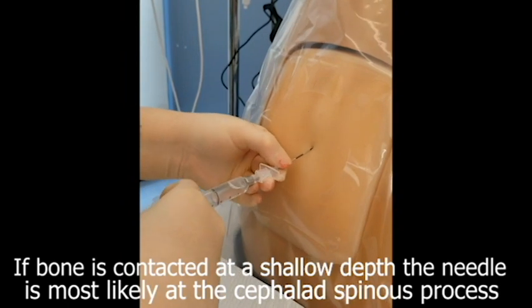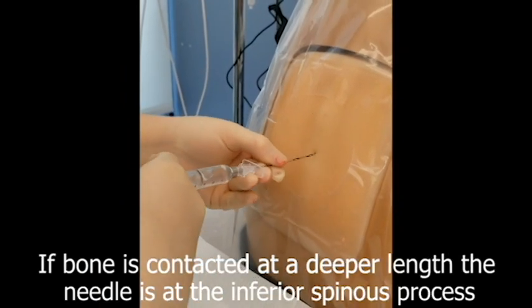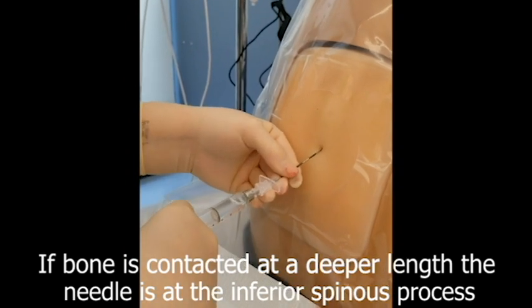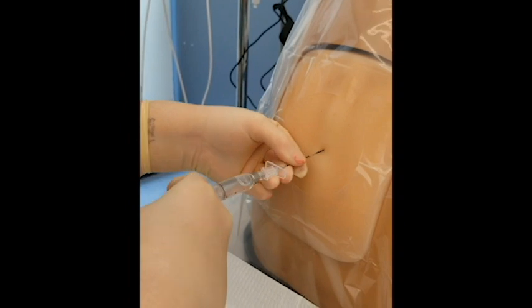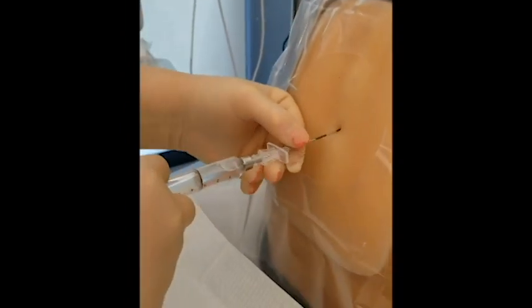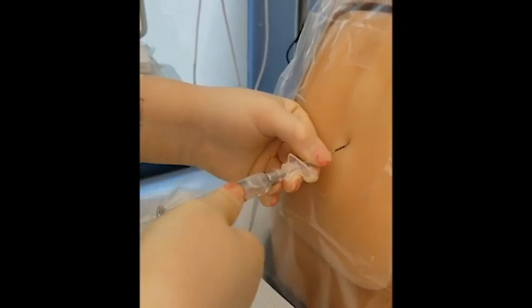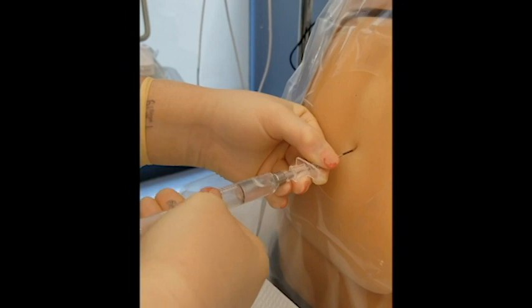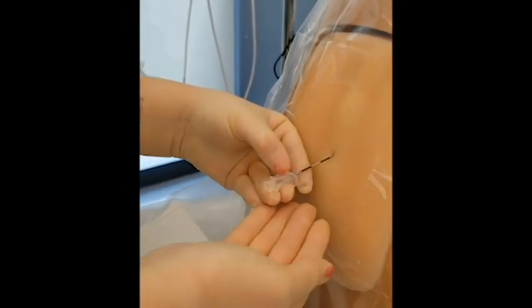If the needle is in ligamentum flavum, the bounce is very firm. Advance very slowly while pushing the plunger until loss of resistance occurs. This is usually very pronounced. Count your markings where you lost resistance.